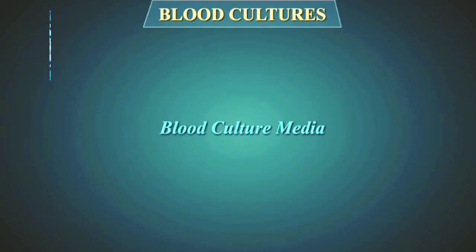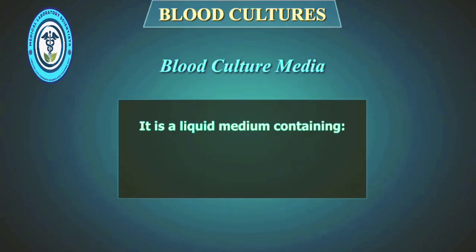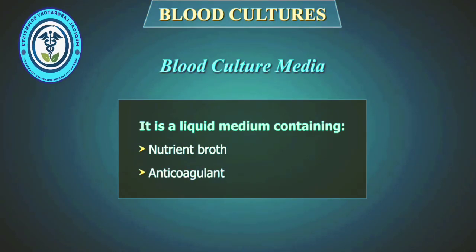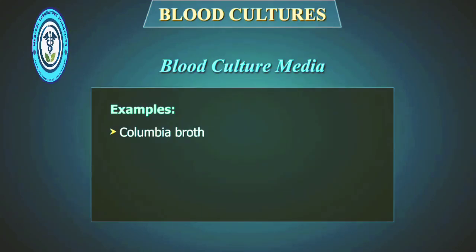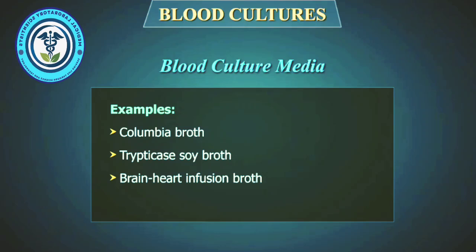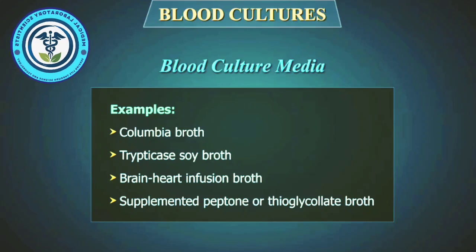Basic blood culture medium is usually a liquid medium containing a nutrient broth and an anticoagulant. Columbia broth, trypticase soy broth, brain heart infusion broth, supplemented peptone, or thioglycolate broth are some of the liquid media available commercially.